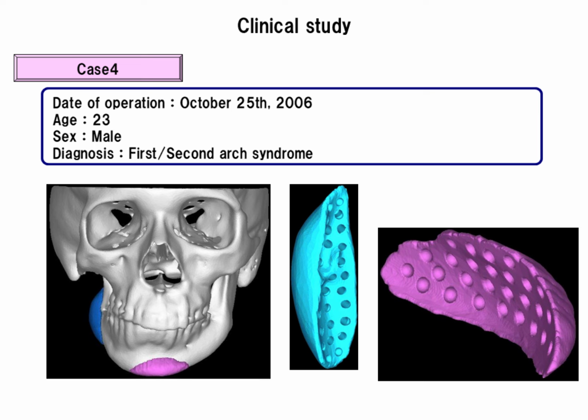The patient's hemifacial microsomia was classified as unilateral Pruzansky type 2. The mandibular deviation was severe and associated with malocclusion, which was treated with bilateral mandibular distraction osteogenesis and LeFort 1 osteotomy. 18 months later, right mandibular reconstruction and genioplasty were performed, using CT bone to correct the mandibular asymmetry.